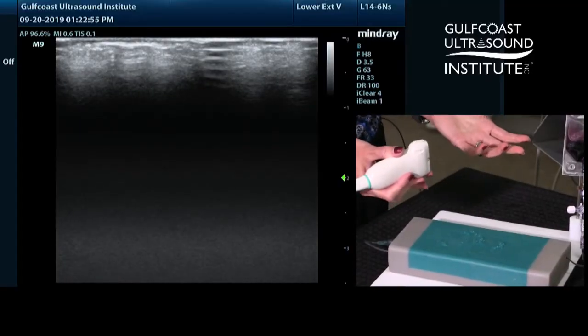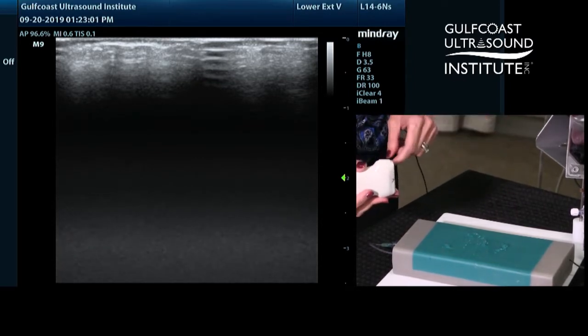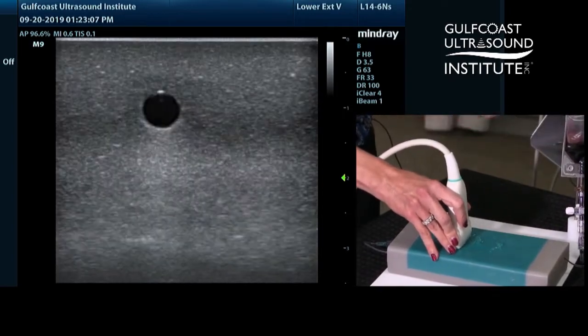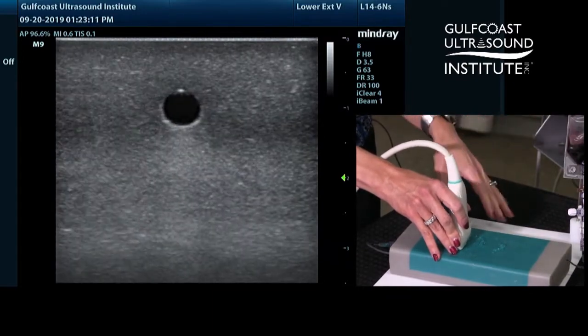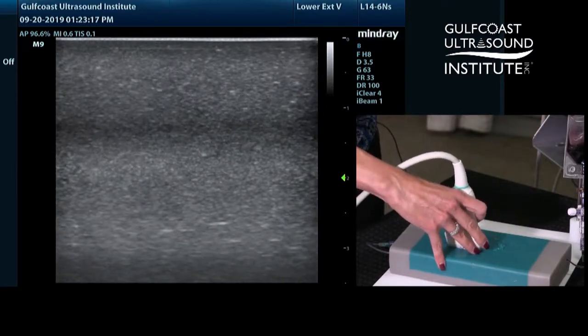When you're first learning ultrasound, learners can struggle with keeping their target centered on their ultrasound machine, particularly when it comes to vascular access. For example, when you're scanning — in this case on this phantom — you may be rotating from a short axis view of your blood vessel to a long axis view, only to find that as you're turning, you slip off your target and then have difficulty going back to locate the target again.